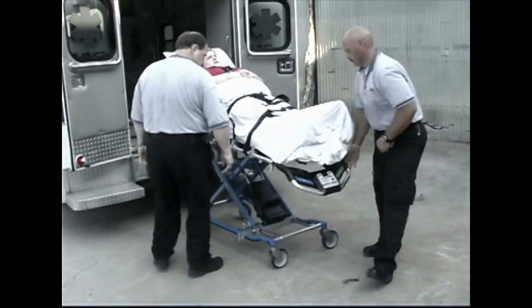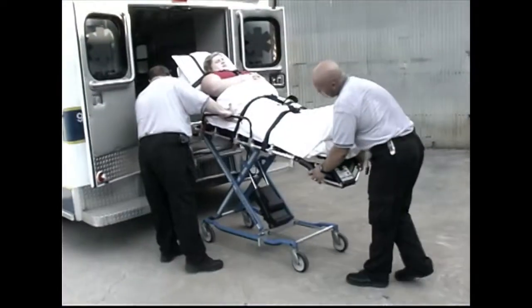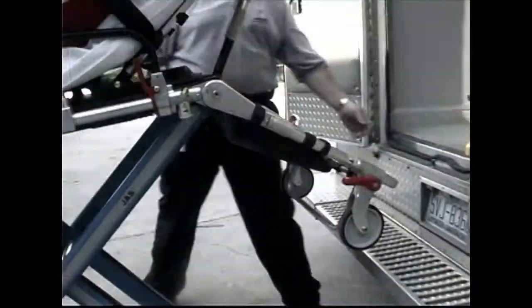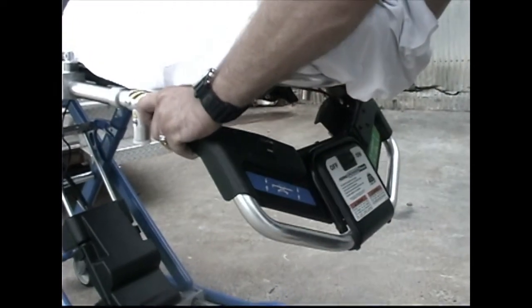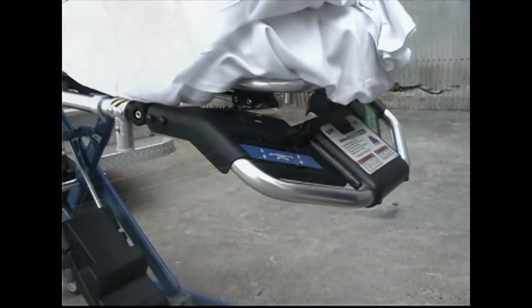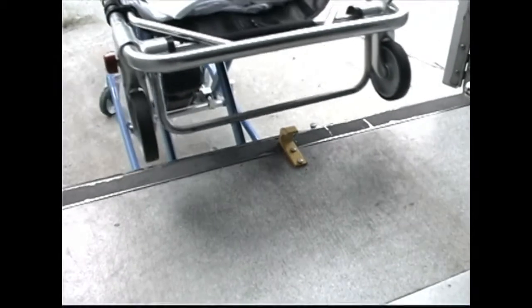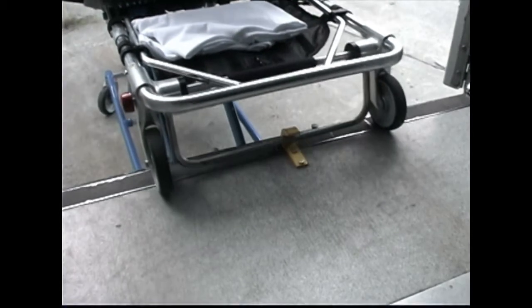To load the cot, raise the ambulance folding bumper if present. Raise the cot to its loading attitude and raise the drop frame to the extended position. Adjust the foot-end lift bar as desired. Verify the lift bar is locked before elevating the cot. Roll the cot into the ambulance until both loading wheels are on the patient compartment floor and the safety bar passes the safety hook.